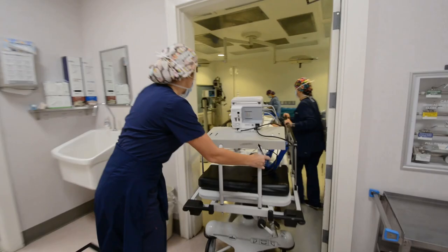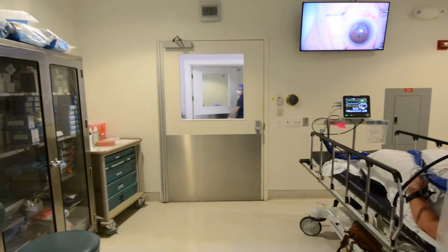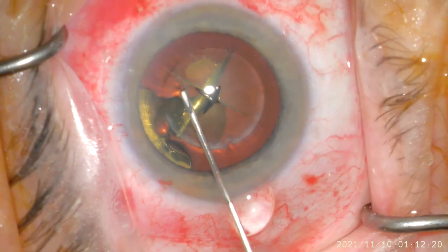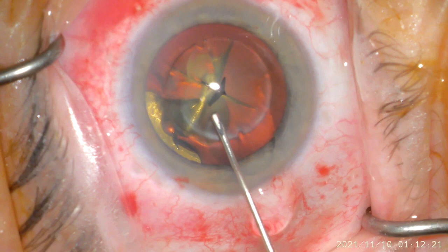After this, we employ IV sedation to ensure that you feel calm and collected prior to and during surgery. You will feel no pain during the procedure, and if you have any questions for the surgeon, this is a good time to ask, although the surgeon will guide you through the procedure every step of the way.